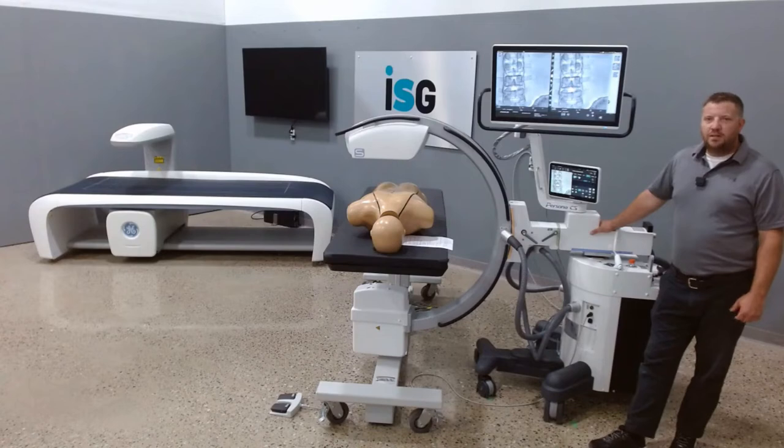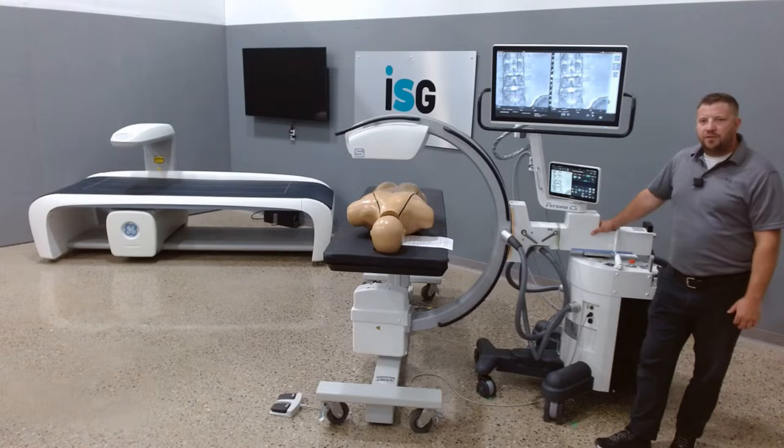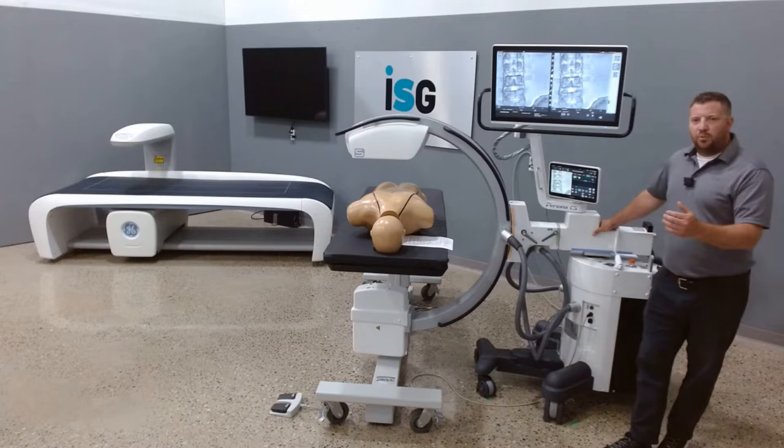Hi, this is Frank Forst, Service Manager at IRAD Sales Group, National Distributor for the Fuji Persona CS C-Arm. Today we are going to do a brief overview of the Persona C-Arm.